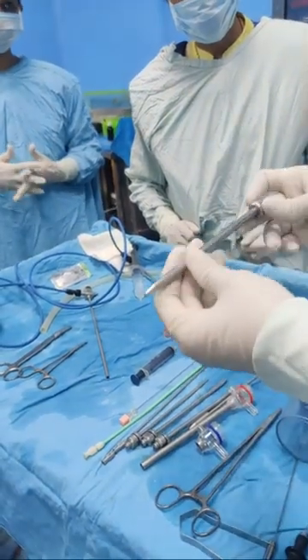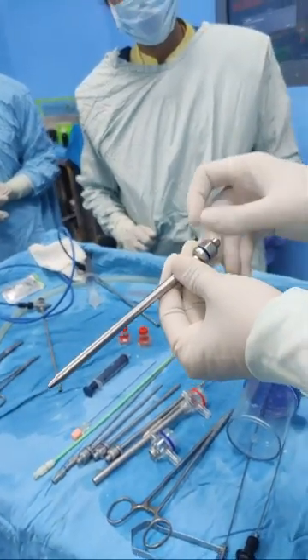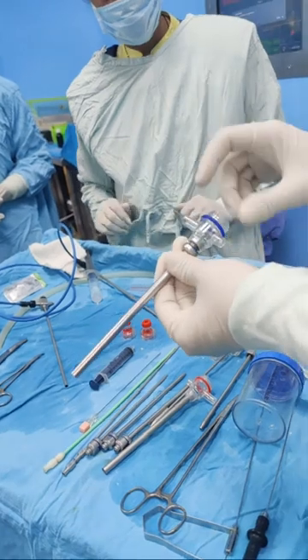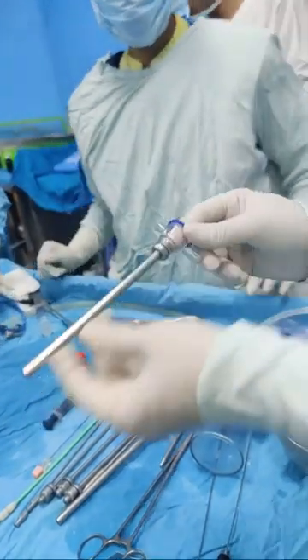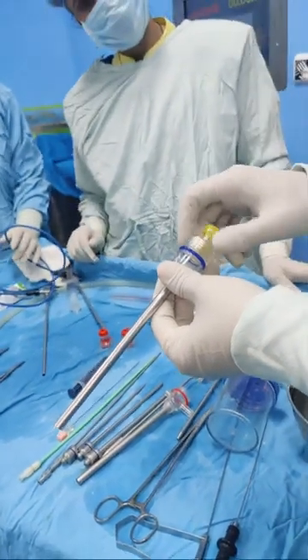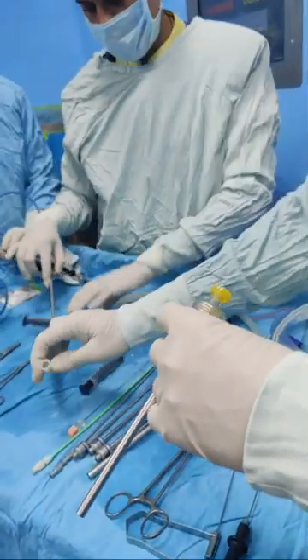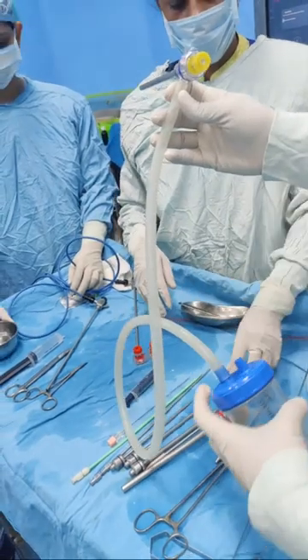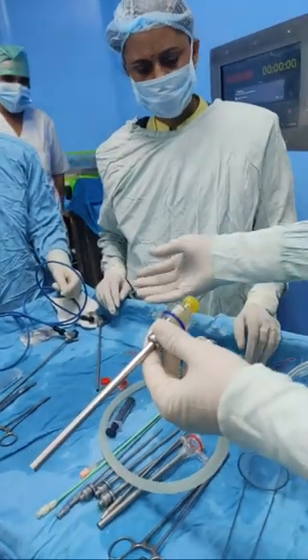So let's consider that we are using 21 French. Over a guide rod, you can insert the sheath, then take out the dilator part, and then attach a connector. After doing a nephroscopy and confirming that the sheath end is in the PC system, you attach a connector. This connector is good for a 16 French nephroscope. Now you attach a suction tube, which is here. This tube is attached and goes to the stone catcher bottle. And from here, another suction tube goes to the suction machine. Now, this is a 21 French sheath, give me 16.